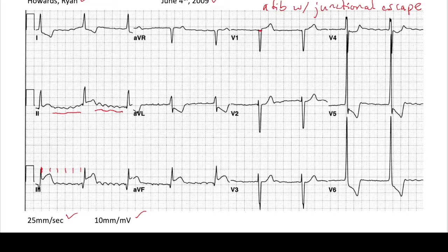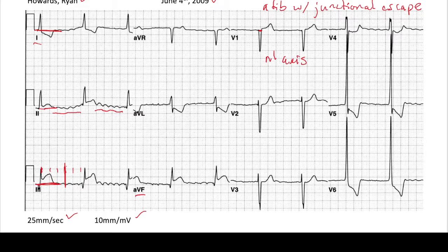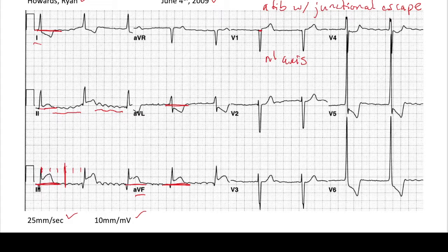Next we look at axis. Lead one is positive, AVF is positive — so it's a normal axis. Then we look at intervals. We can't assess the PR interval because this patient is in AFib. QRS is narrow. QT looks rather normal — less than half of the R-to-R interval; we'd check the QTc on the paper. Then we check for ischemia. Lead one: some ST depressions. In the second beat of lead two: ST elevations. Lead three: definite ST elevations. AVF: similarly some ST elevations — that's concerning. AVR: none. AVL: some ST depressions. V1: slight elevations in first beat, flatter in second. V2: flat. V3: flat. V4: some ST depressions. V5: some ST depressions. V6: some ST depressions.